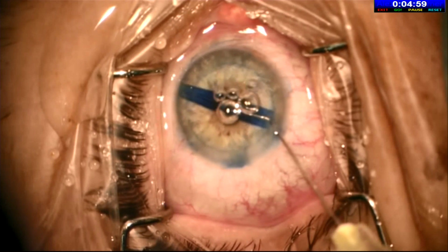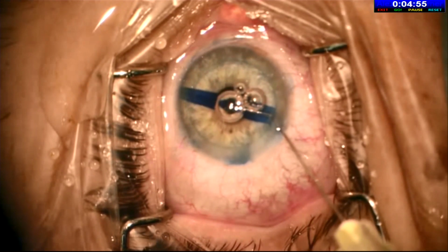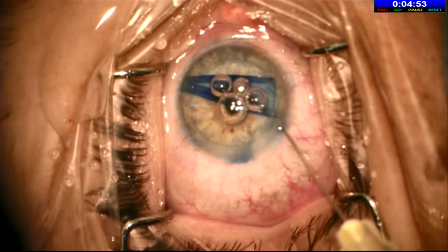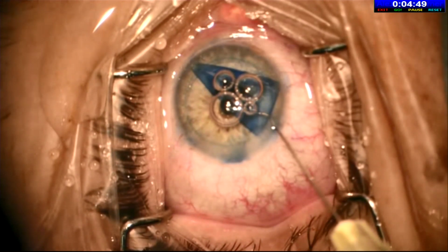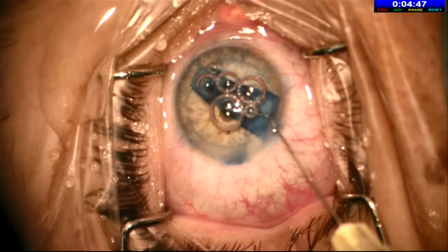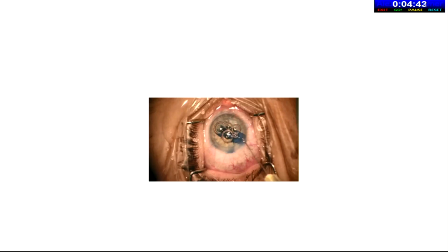Now here's a bit of a messy video. These are when we go back and look at our grafts which were placed upside down. Again, with lots of air bubbles, which are a bit confusing, we're trying to open the graft, thinking that it's in the correct orientation and that the air bubbles are anterior to the graft. And then it wouldn't open because, of course, it's actually upside down, and then going in with a cannula and being fooled by a false Moutsouris sign.